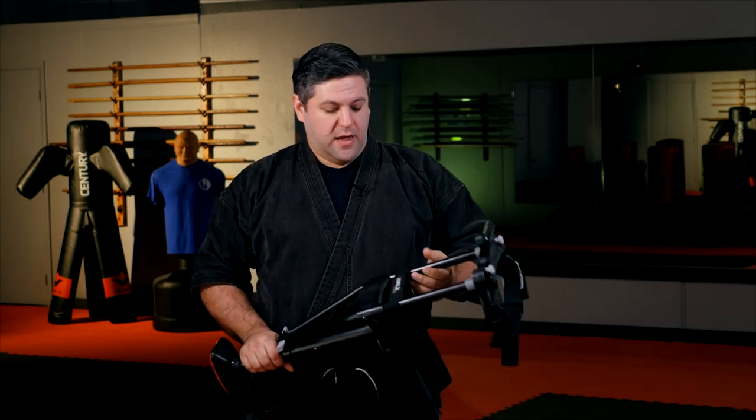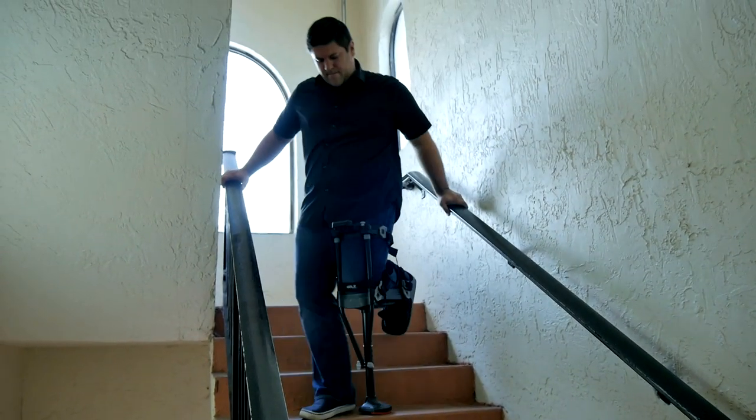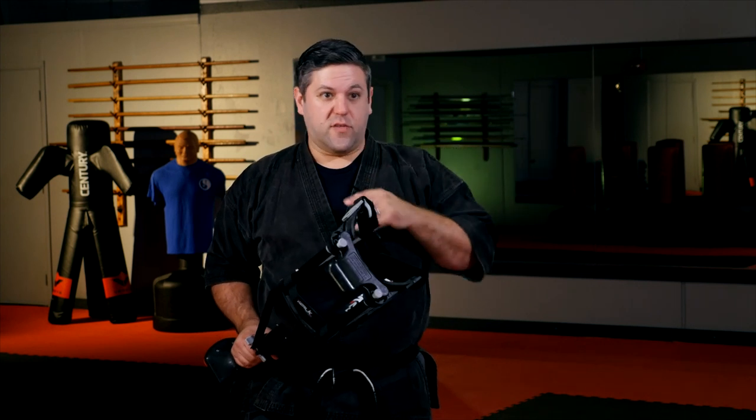Don't throw those crutches away — I would hold onto them because I actually found they came in handy in conjunction with this many, many times. While you're able to walk on this, one thing you're not going to be able to do is go long distances on this alone. You're not going to be very fast, and it does get tiring. So I actually kept the crutches with me. If I was getting out of the car and had to go across a parking lot, I could fly with the crutches while wearing this — you just lift your leg up and go. When you get where you're going, put the crutches in your shopping cart and go about your day.